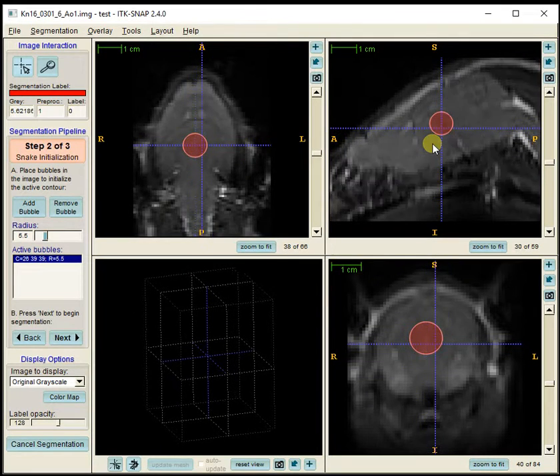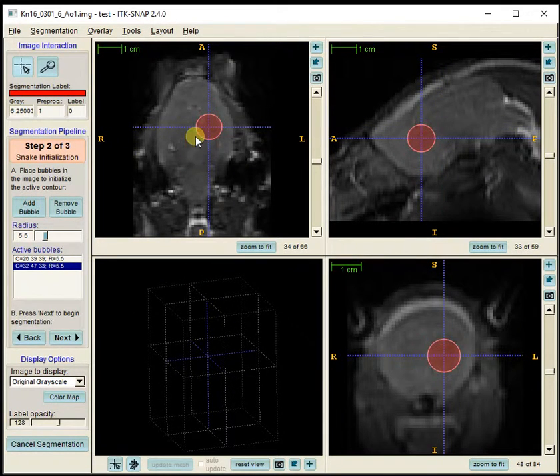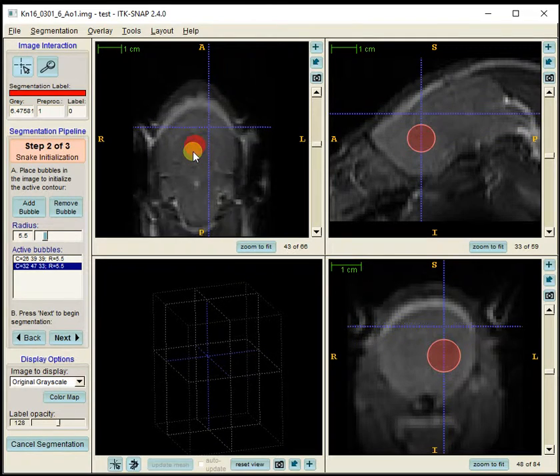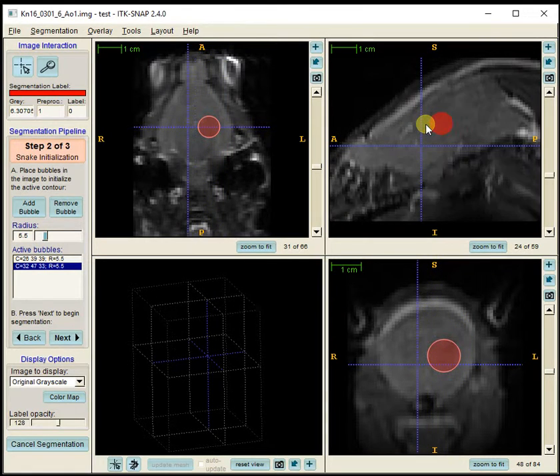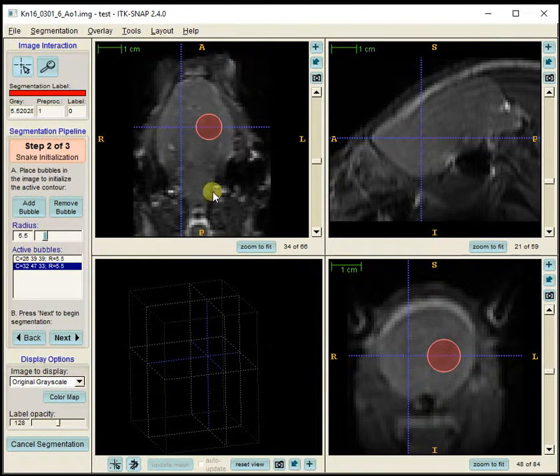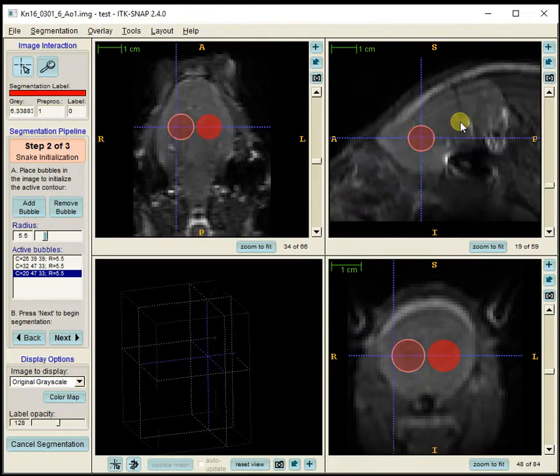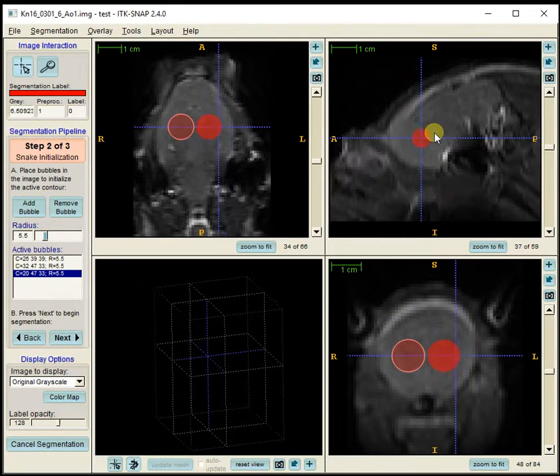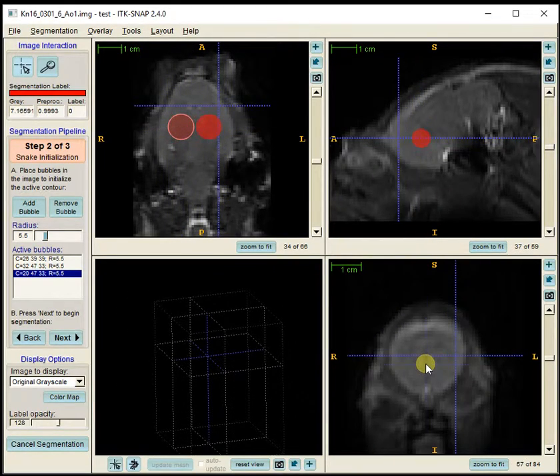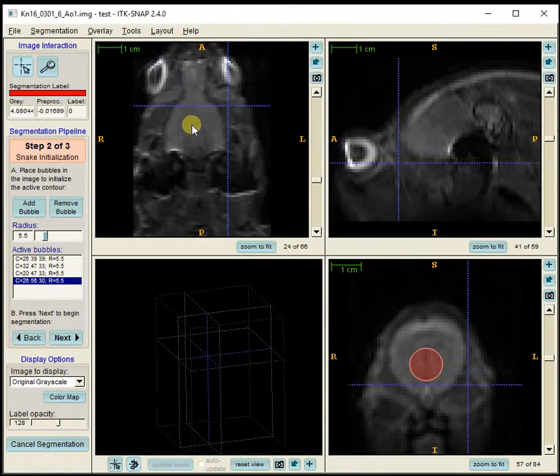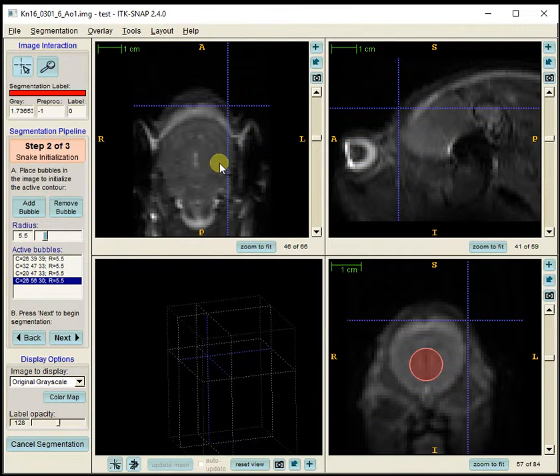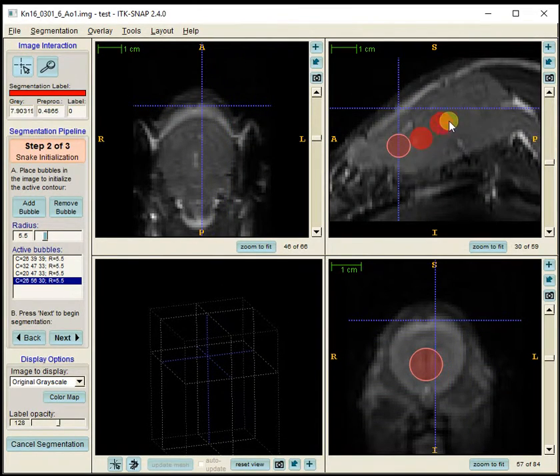I'll add a bubble there, then move and add another one. Five or six is a good number, and I can add bubbles on any of the planes. Going to the axial view, I'll add another one there and another one. That should be good enough.